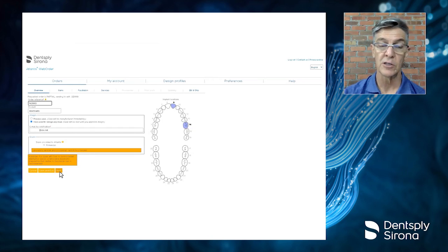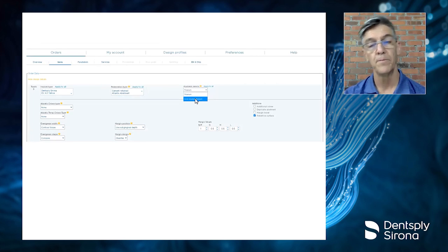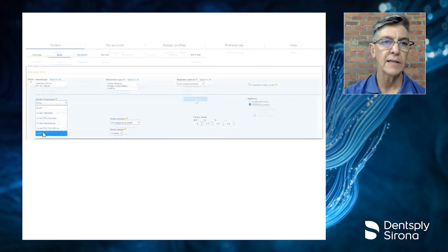Now, there is an option just to say, let Atlantis design the abutment, but the laboratory has the expertise in designing what we want to achieve. So they're going to go through this and order the necessary abutment, in this case, an Atlantis CustomBase Solution. They have an option of choosing gray or gold shaded. My particular choice is gold shaded. And then the next thing they're going to do is choose core file.